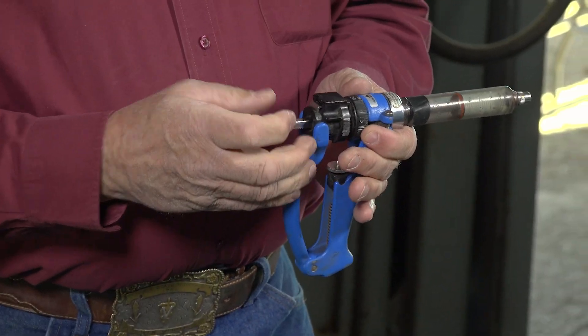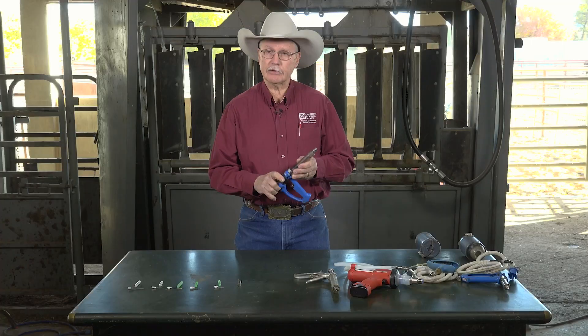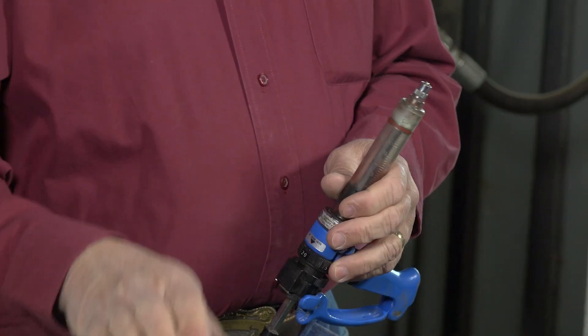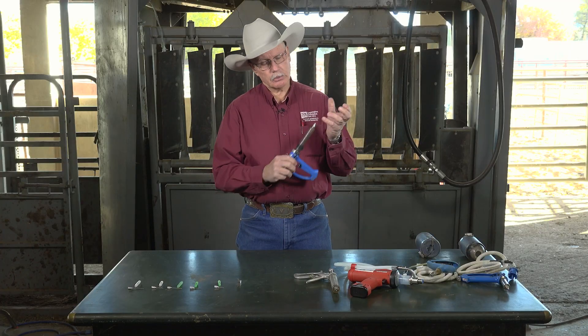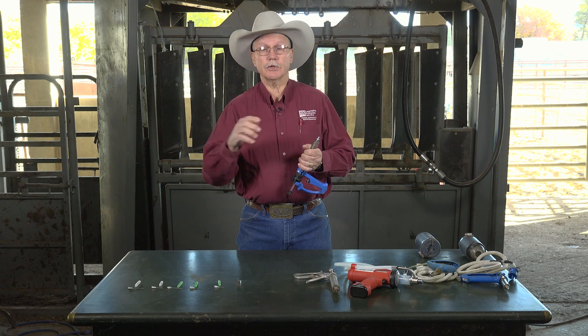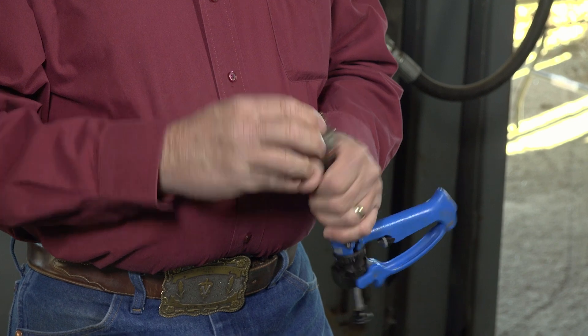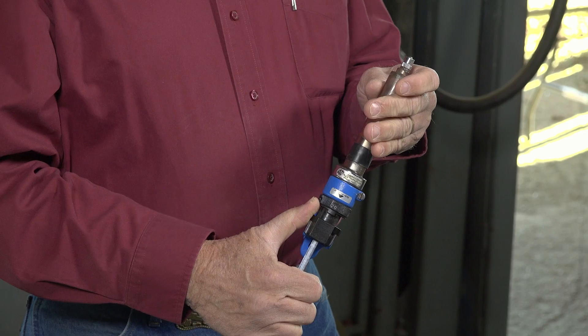These types of syringes are designed so you can use them for multiple doses. You have to refill them each time, and it's very important that when you get ready to fill the syringe, you put a clean needle on each time. You never puncture a bottle of vaccine or product with a needle that's been in an animal. So you always change and put a clean needle on before you ever puncture the bottle to fill your syringe, so the system remains clean.